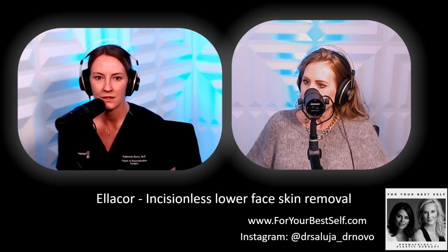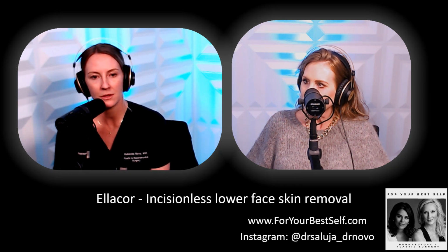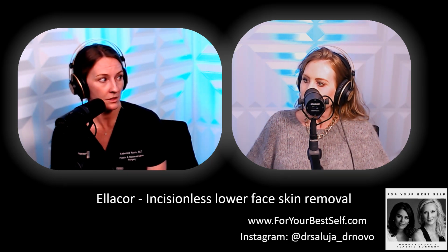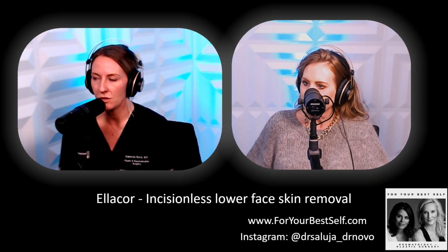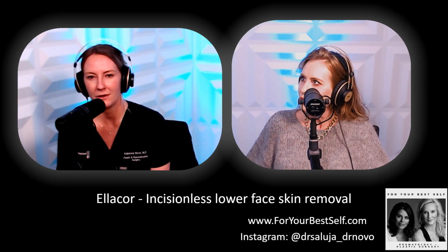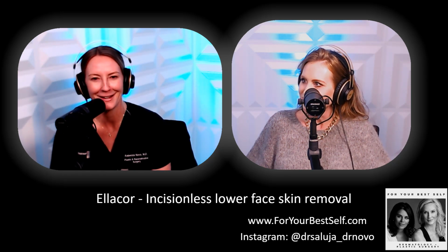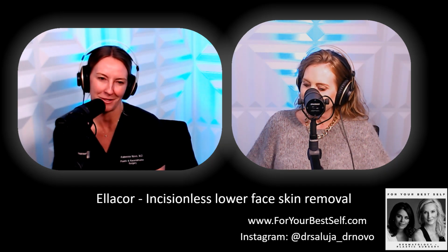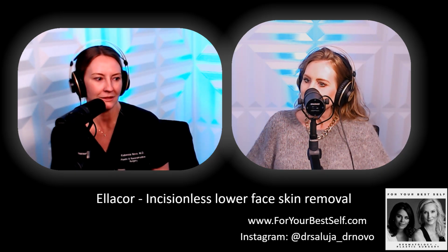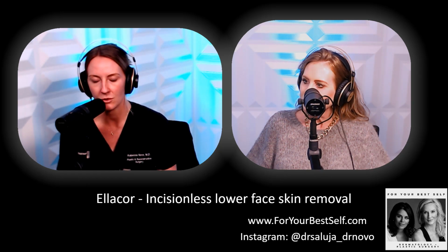Yeah, and I think that's important to point out. It's not that you're completely healed and flawless to go kind of bare skin presentable. There is some evidence of red, it looks like red pin marks, kind of in a square grid, and they do look a little bit irregular. When I first was watching the results and the post recovery practitioners, my OCD self was really annoyed that it wasn't a perfect grid. But on the 3-dimensional face, it's really impossible to get a perfectly spaced, perfectly symmetrical grid. So the most important thing is that we're not overlapped, that we do have some gaps, we're not over treating. As I mentioned, that's when you increase your risk of scarring.